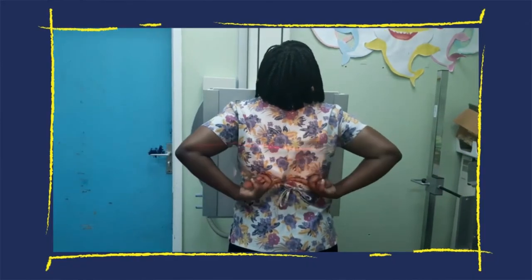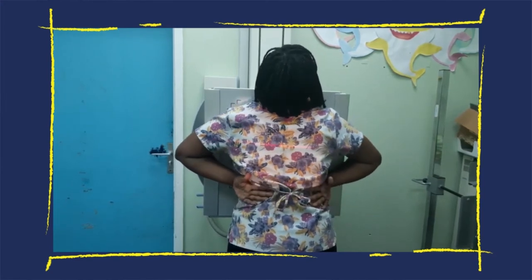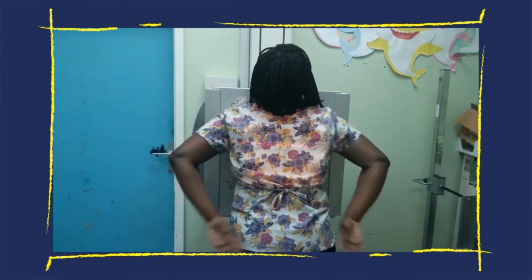A big tip I use all the time, especially when you're not sure how to place the cassette: yes, you're looking at the width of the chest to see if it will fit, but another thing to consider is length — you don't want to clip the lower portion of the anatomy. What I tend to do is feel for the lower costal margin. That helps me so much. A lot of times the lower border of the chest lies about three inches above the lower costal margin. So if you palpate for the patient's lower costal margin and see the patient has a very long thorax, you'll know to put the cassette lengthwise. You would know for a fact that the chest is fitting and nothing is going to cut.